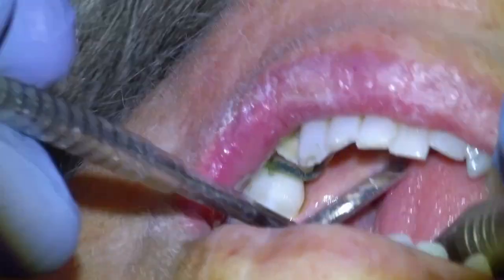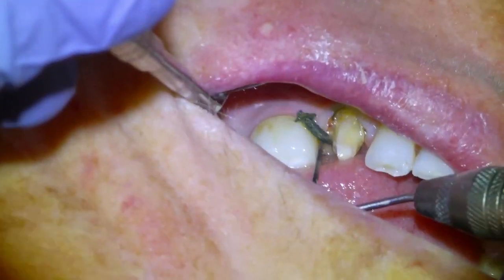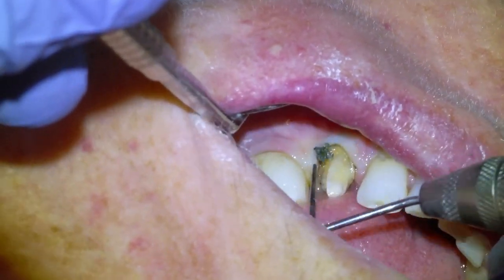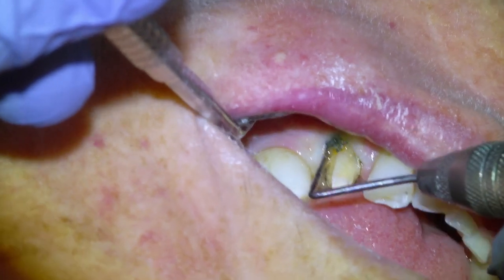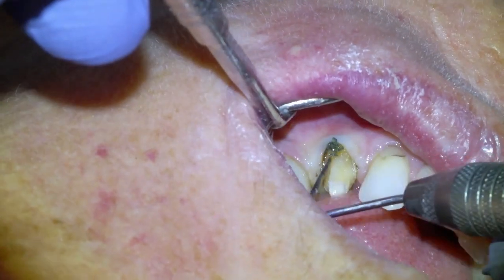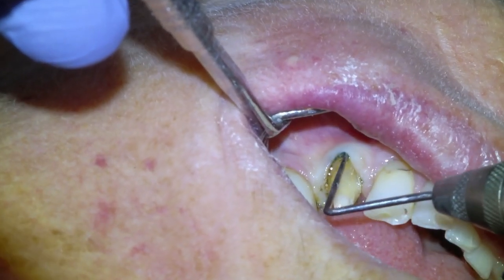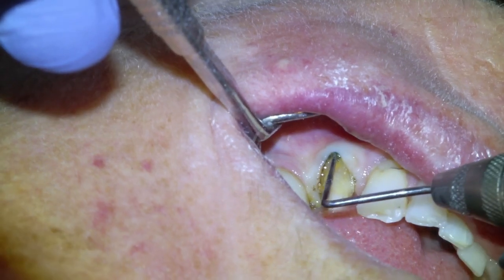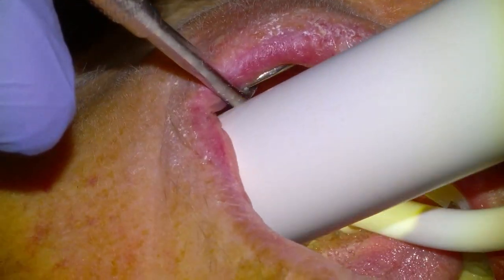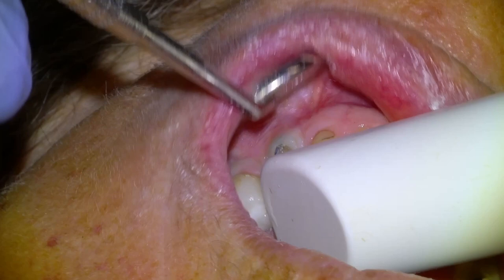I like to keep my armamentarium as minimalistic as possible, and I find that perioprobes work just fine. I've used cord packing instruments and was never a huge fan, so I use the perioprobe to get the cord down, verifying that we have direct visual access to our margin circumferentially. When we're satisfied, we'll take our scan. I have a Trios 4 that I'll be looking back and forth between the intraoral and the screen to verify that we have all of our surfaces captured.